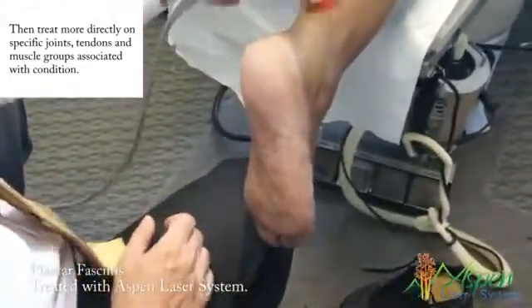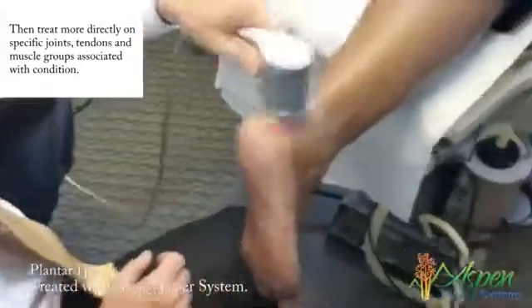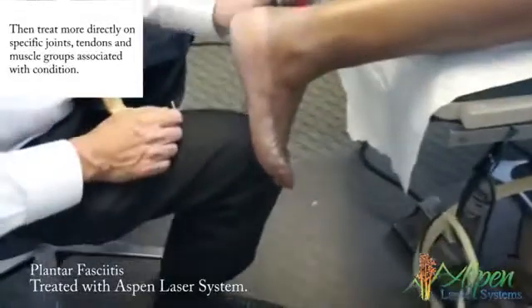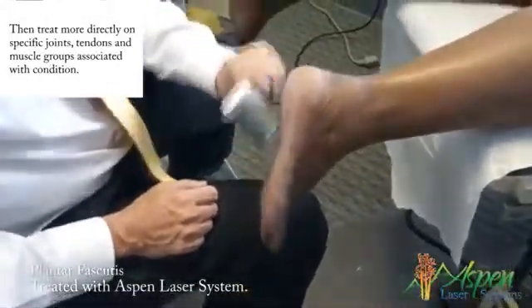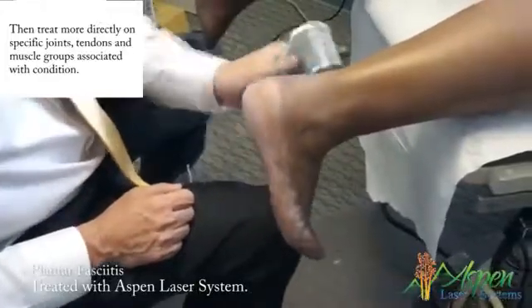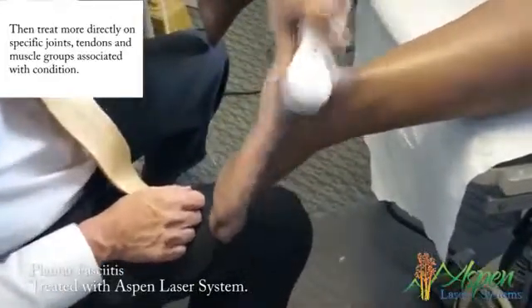Why don't you slowly move your foot up and down, back and forth — towards you and away, slowly. If it hurts we don't have to do it; it should feel looser over time. In about a minute it'll get looser — the joint mobility on this is amazing.